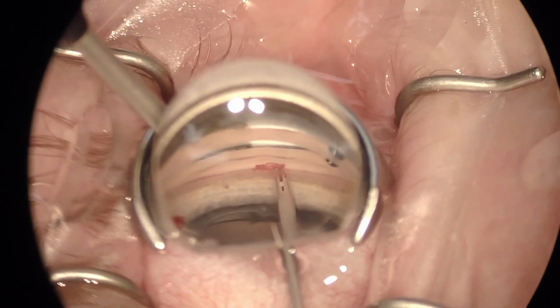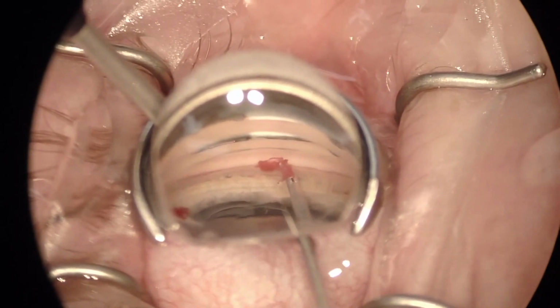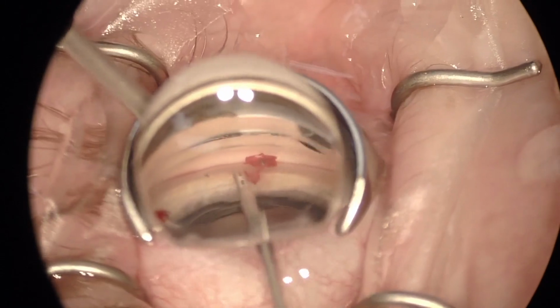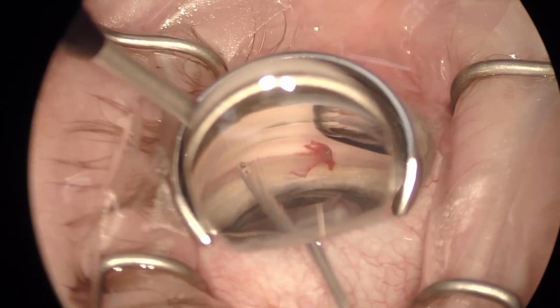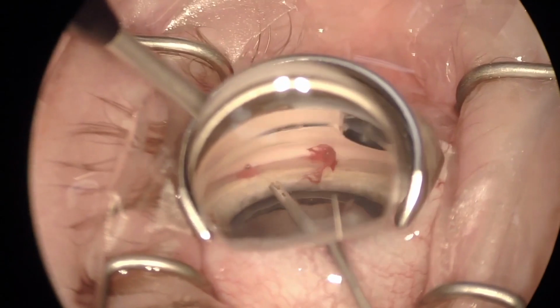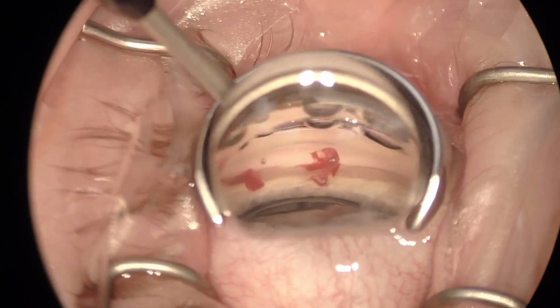There you can see I fire the first stent down, and there's some reflux bleeding, which is not uncommon with this procedure. And instead of messing around and trying to figure out if that's in good position or not, I still have 1 stent to deploy. So I move over to my second target a couple of clock hours away and depress the TM a little bit and fire the second stent down. And again, you get some reflux bleeding there as well.